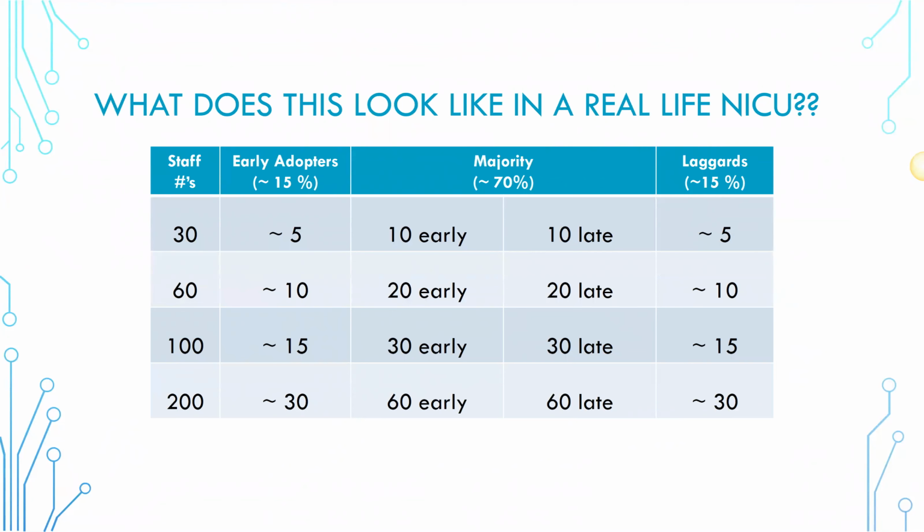Then we also have full EEG devices that have the ability to run aEEG modules on top of them, because remember, aEEG is transformed from raw EEG data. And so when we're looking at that, all we need is just the EEG signal collected.